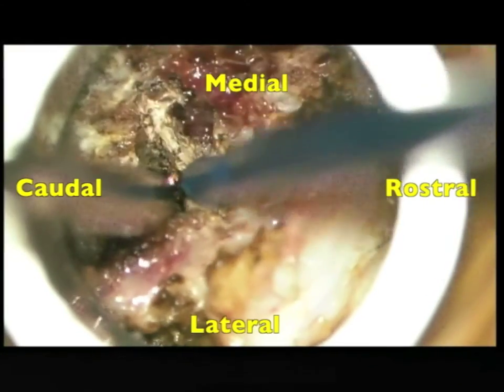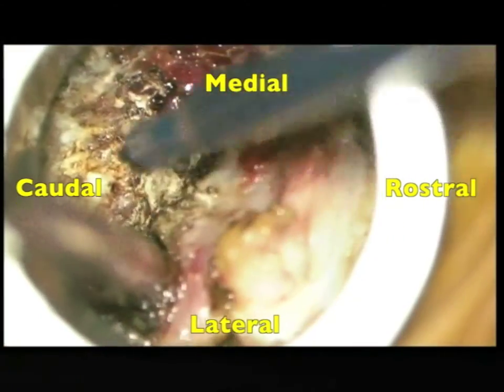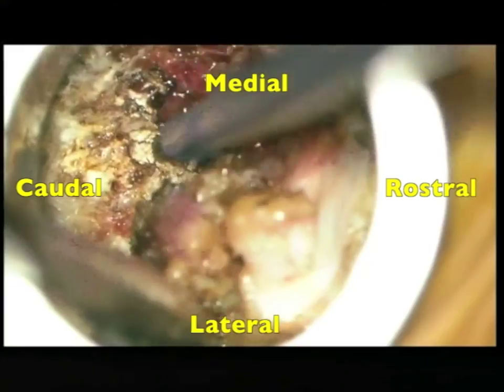The soft tissues are carefully dissected off the underlying lamina. The high-speed drill is utilized to remove the caudal end of the rostral lamina down to the depth of the ligamentum flavum.